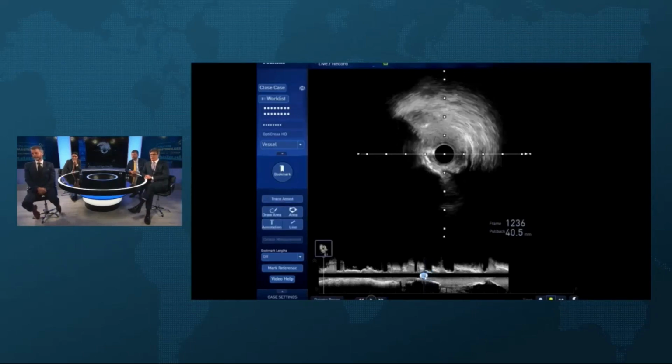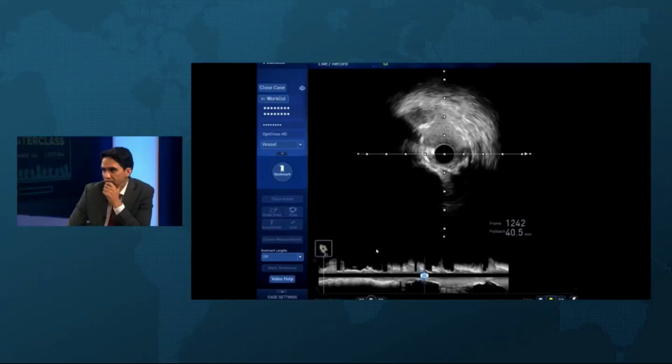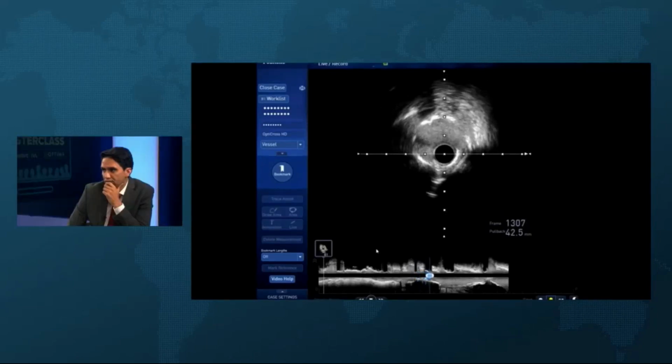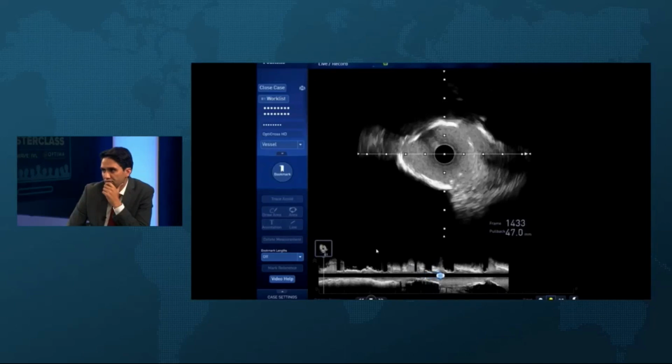So there is this concentric stuff, and you see a beautiful movement of the broken plates here as we come through. So you see a lot more movement in the calcified plaque. See that there? Almost floating. Really nice. Great.